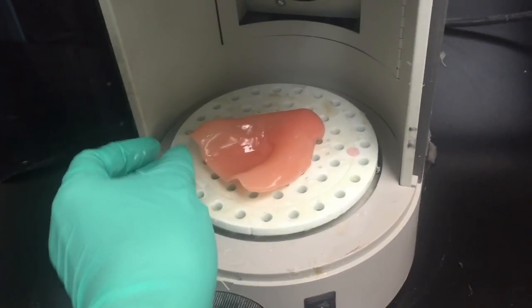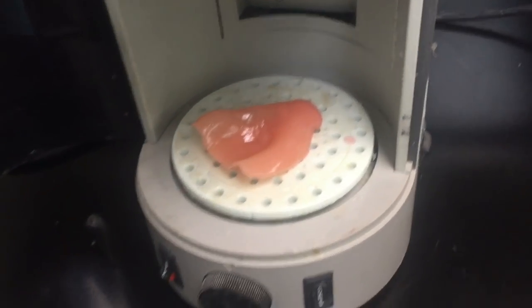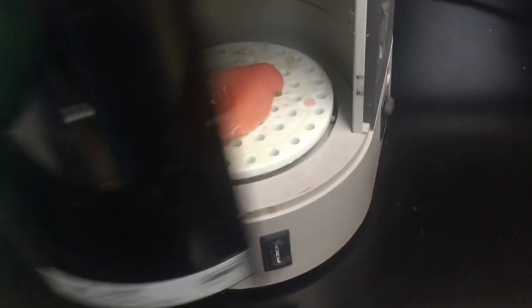It cures for about three minutes, and then it's slightly hardened so I can take it out. Then I apply some coating on it and place it back in the machine to help it cure again. And there you have it — that is how you make a custom tray.